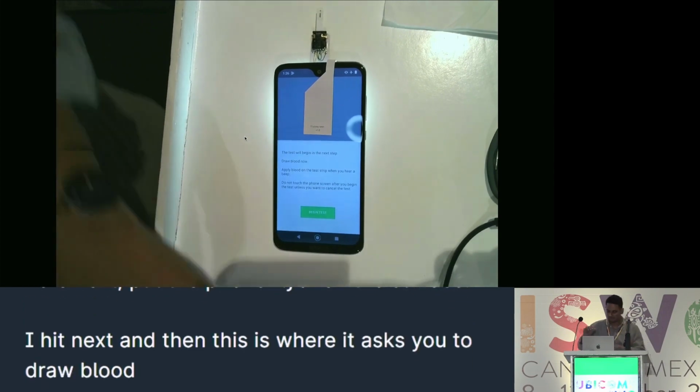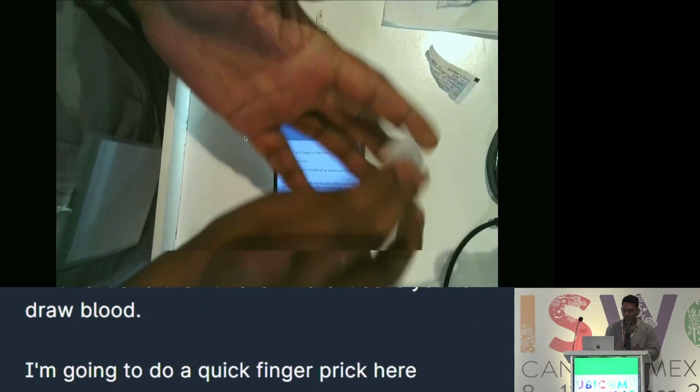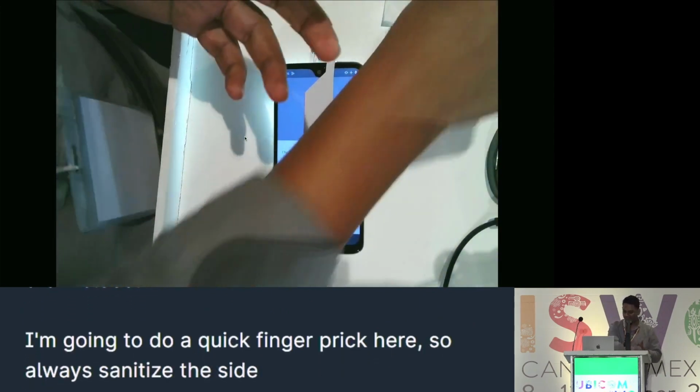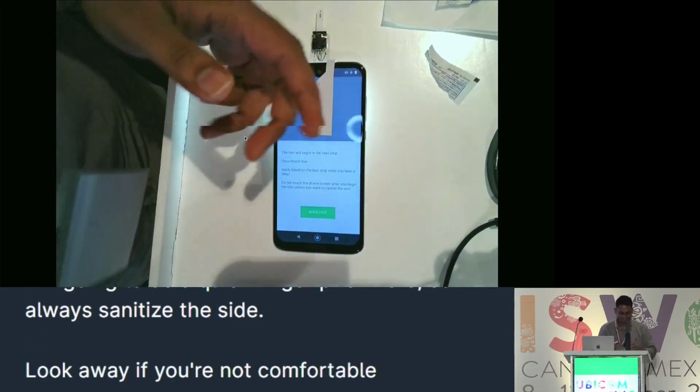I'm going to do a quick finger prick here. So always sanitize the site. Look away if you're not comfortable.